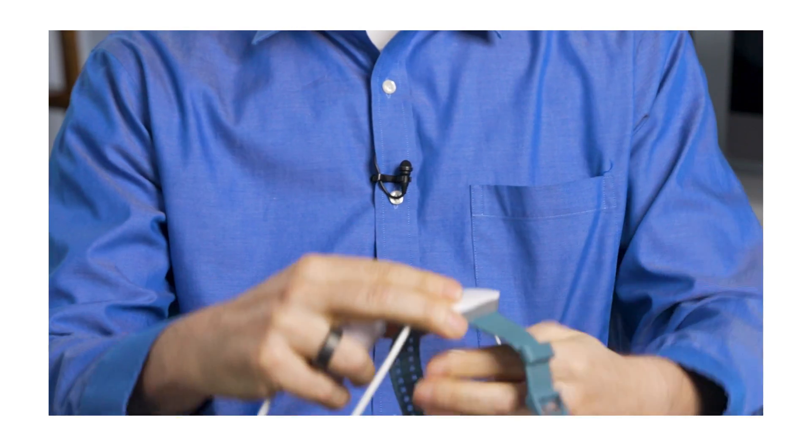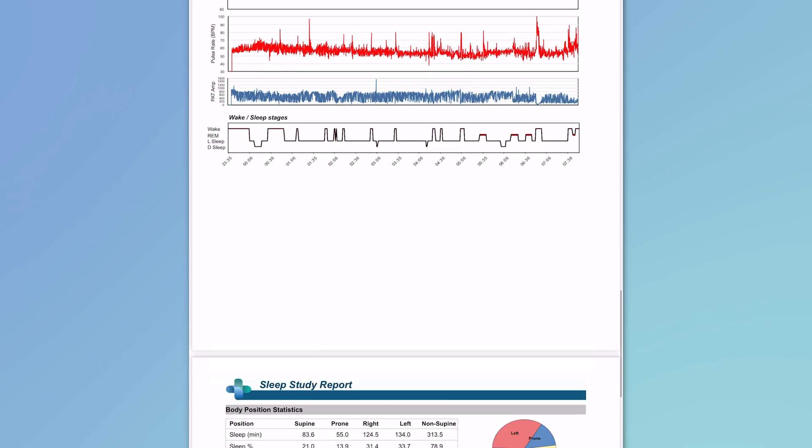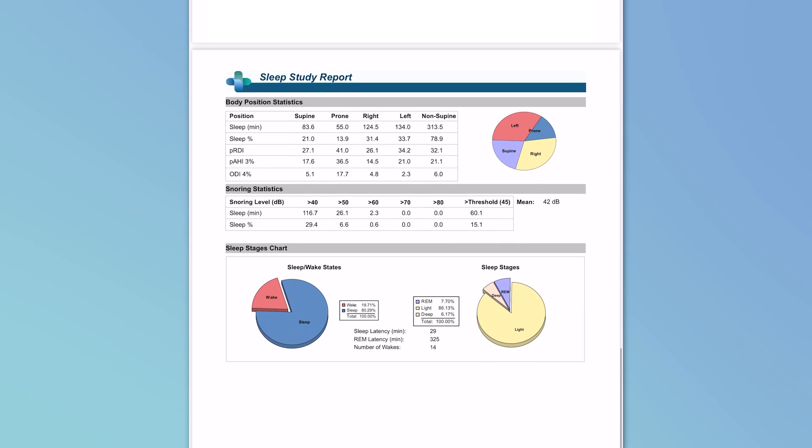All this requires is a sensor for your chest, one for your finger, and then this piece that you wear like a wristwatch. I wanted to show you what an at-home sleep test tracks and the kinds of information that it looks at, so you can see exactly what your doctor would be looking at.